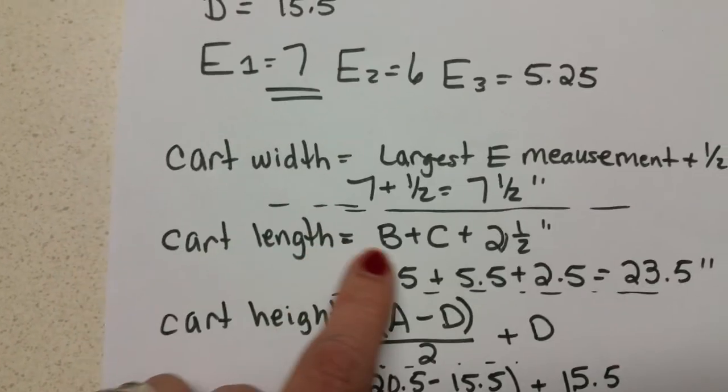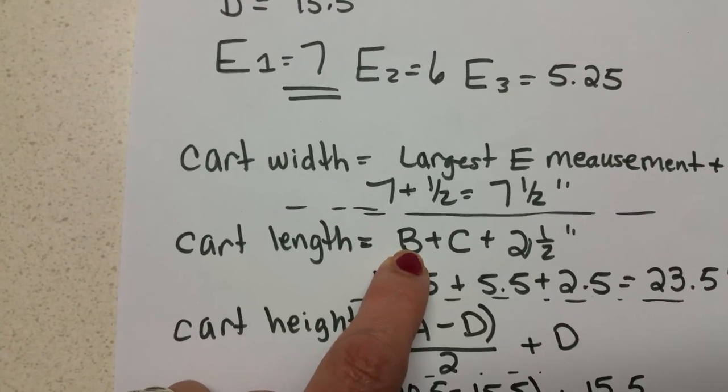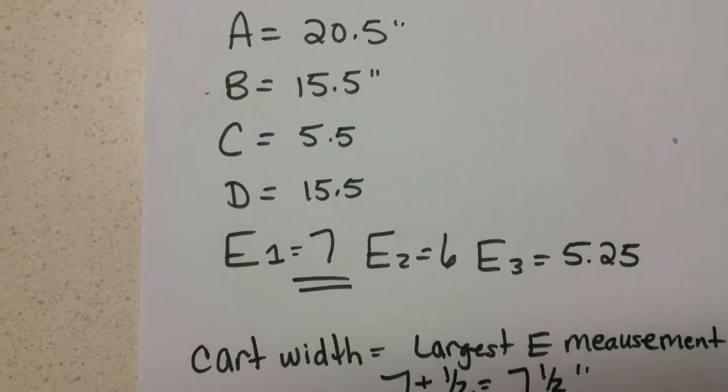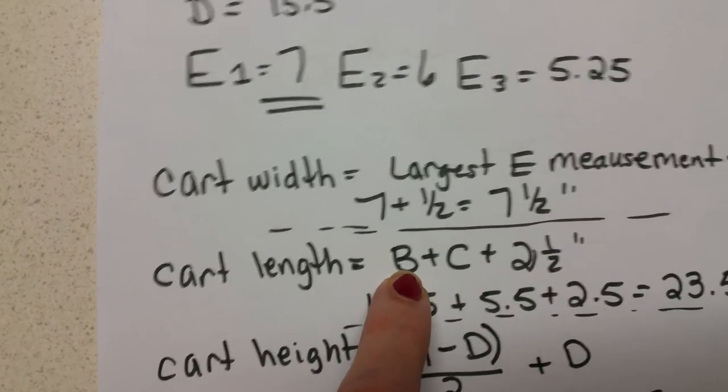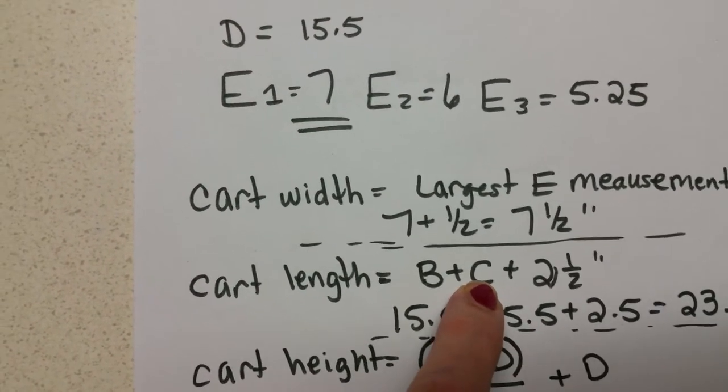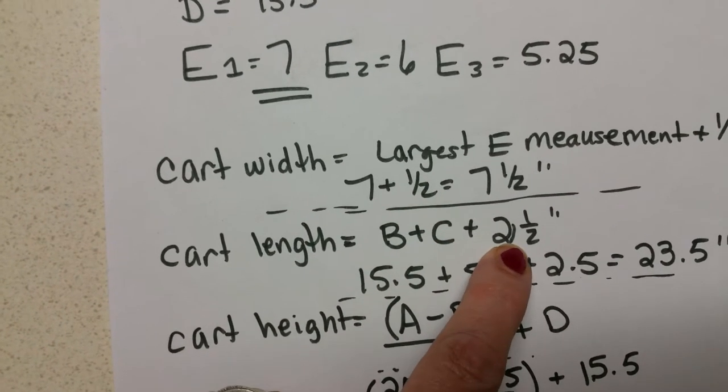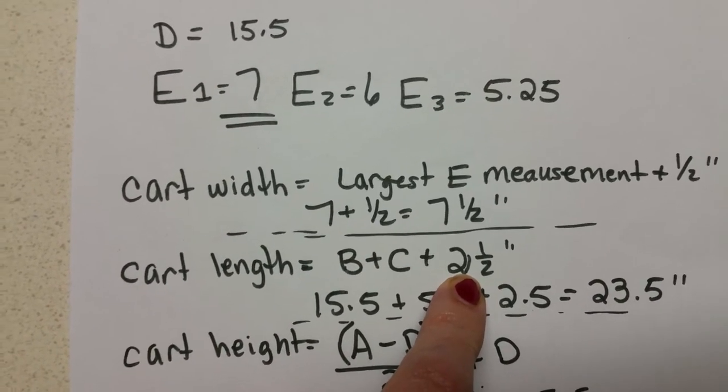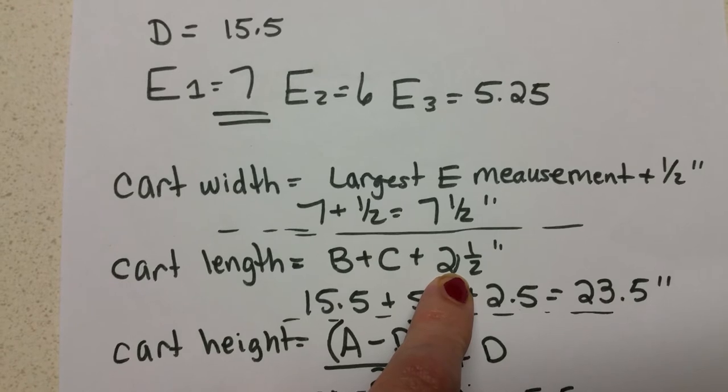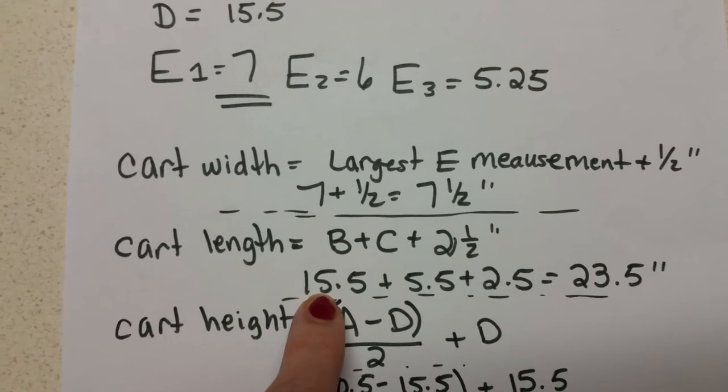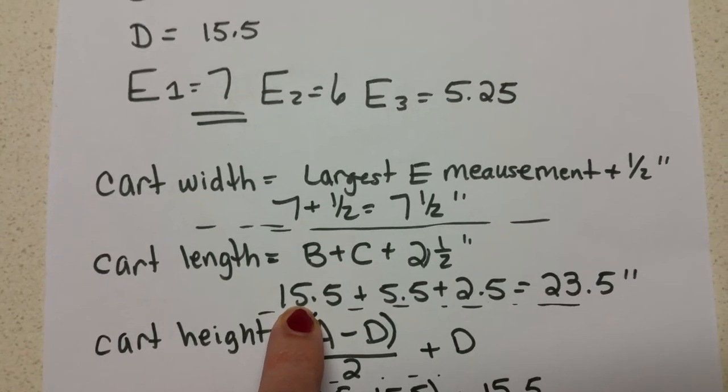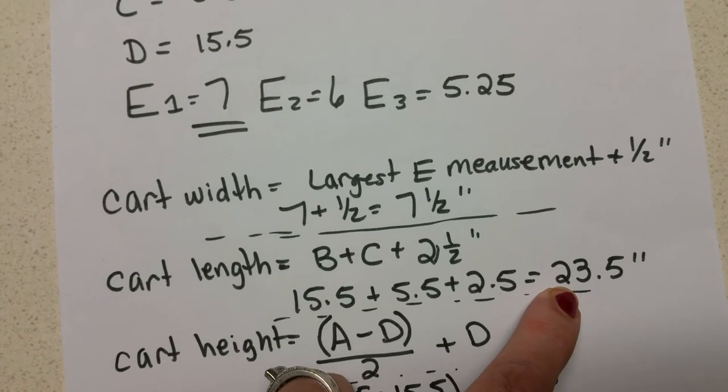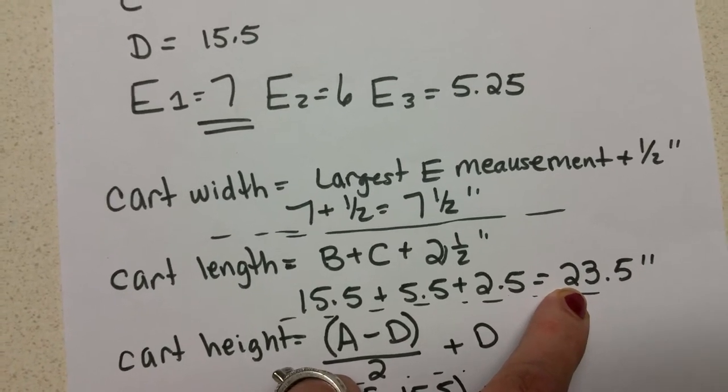To figure out cart length we're taking the B measurement, which was the distance from the middle of the front shoulder to the beginning of the back leg, plus the C measurement which is the back leg, and then we're adding two and a half inches for an average size dog. So for us in this example that's fifteen and a half plus five and a half plus two and a half gives us that our cart length is going to be twenty three and a half inches.